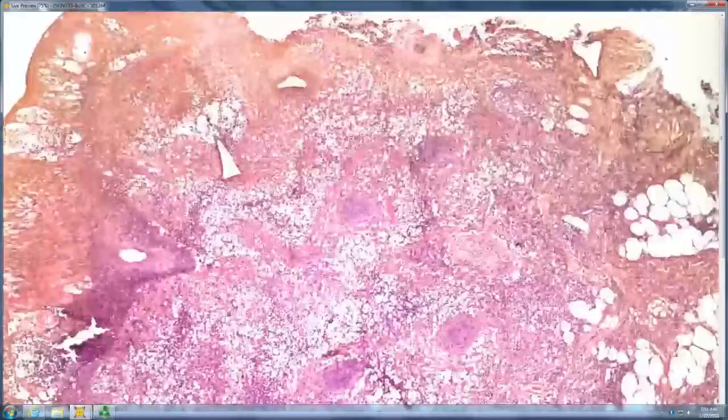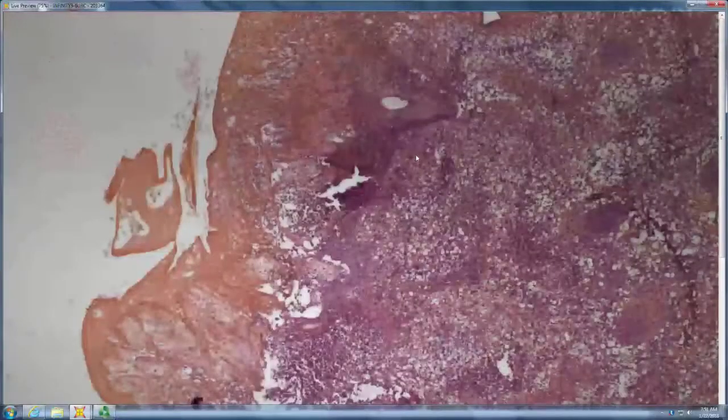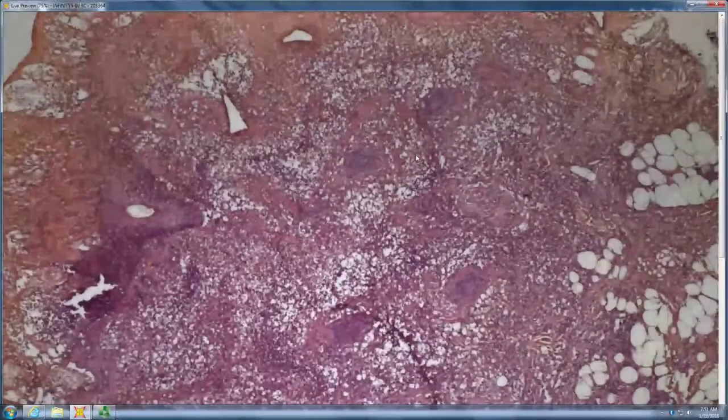This is not fungal at all. I happen to know this patient, which is the only reason I know what it is. We need to relabel that. That is iododerma. Okay. Acute iododerma. Save that one so it's usable.